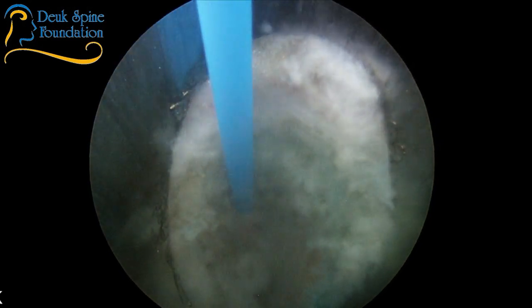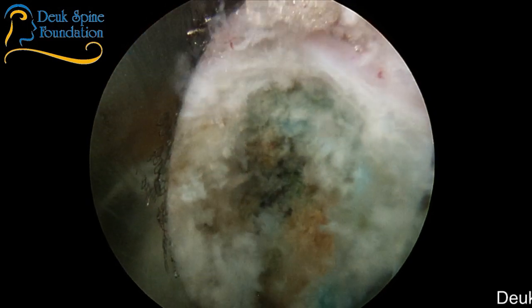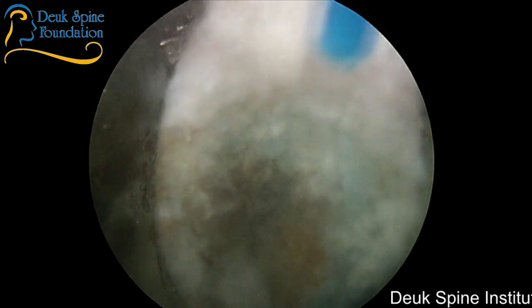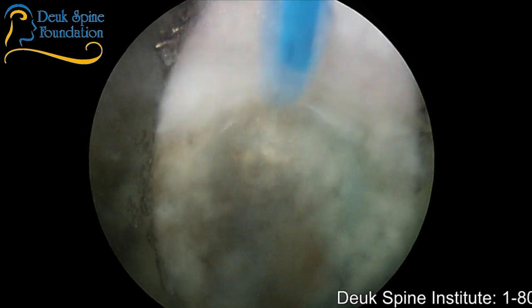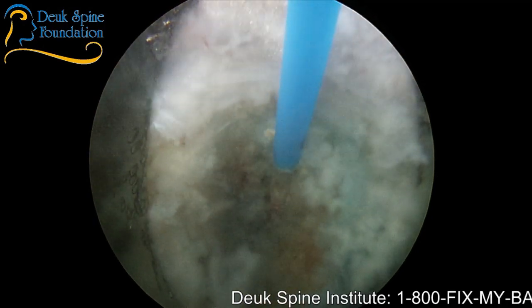And I'm just about done with this one. There's a little bit more to get, and then I'll be done. I'm trying to get more medial by angling more medially. See all that? That herniation is kind of wrinkling up there as I zap it with the laser.